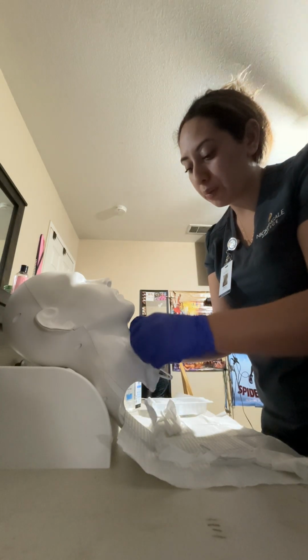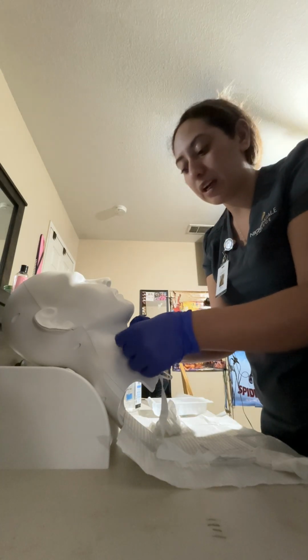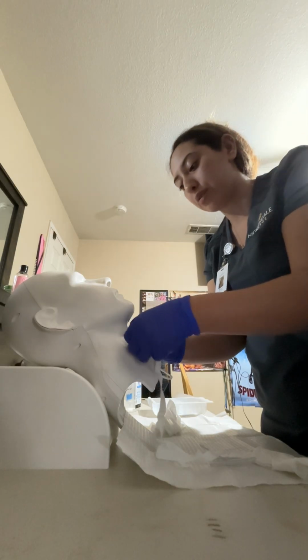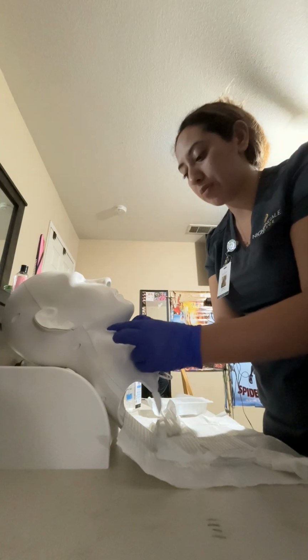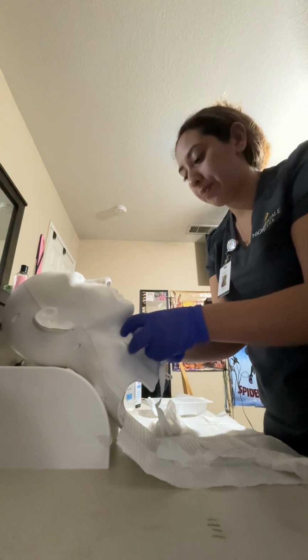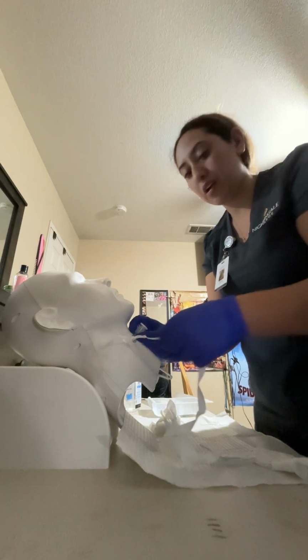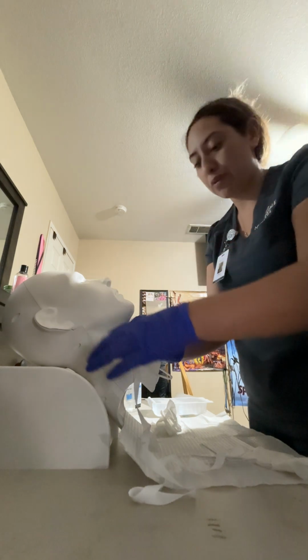That's to make sure that we have the trach ties tight enough that it won't dislodge, but also loose enough that it doesn't cause the patient any skin integrity issues or skin breakdown. Okay, so I have tied a knot here on the tracheostomy and we will wrap this around.